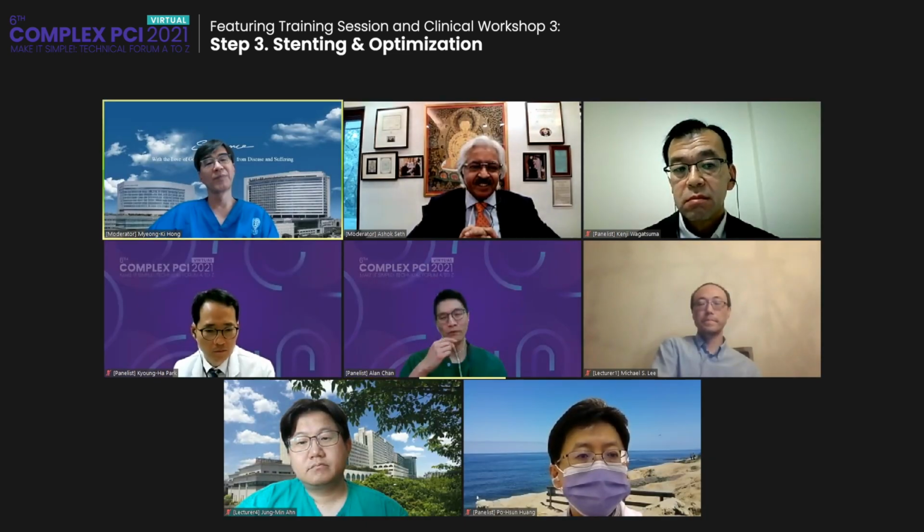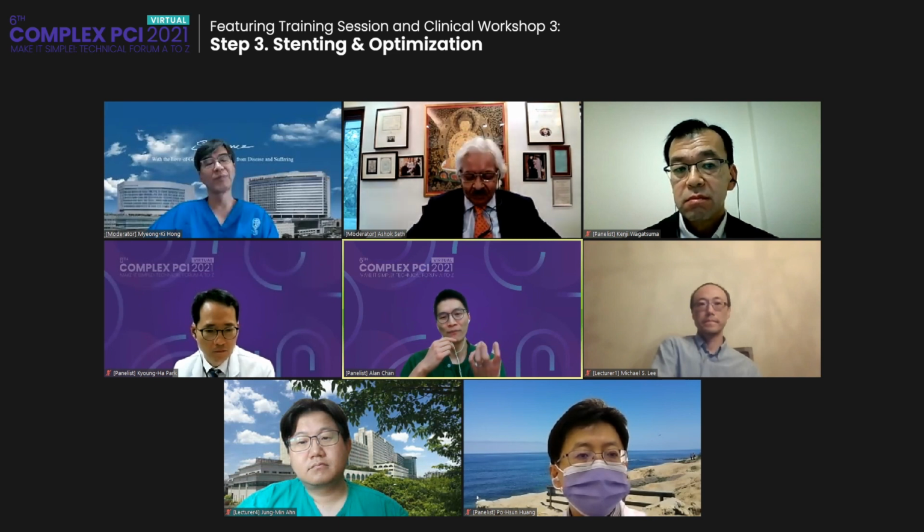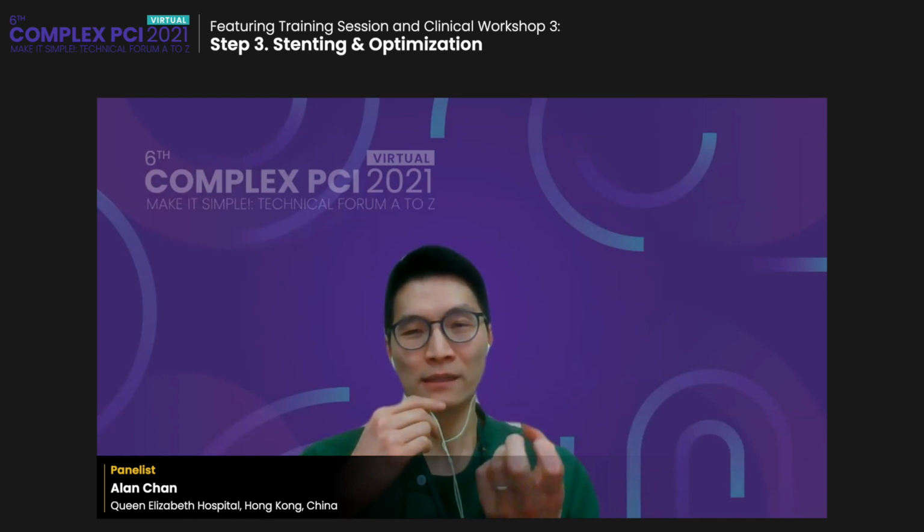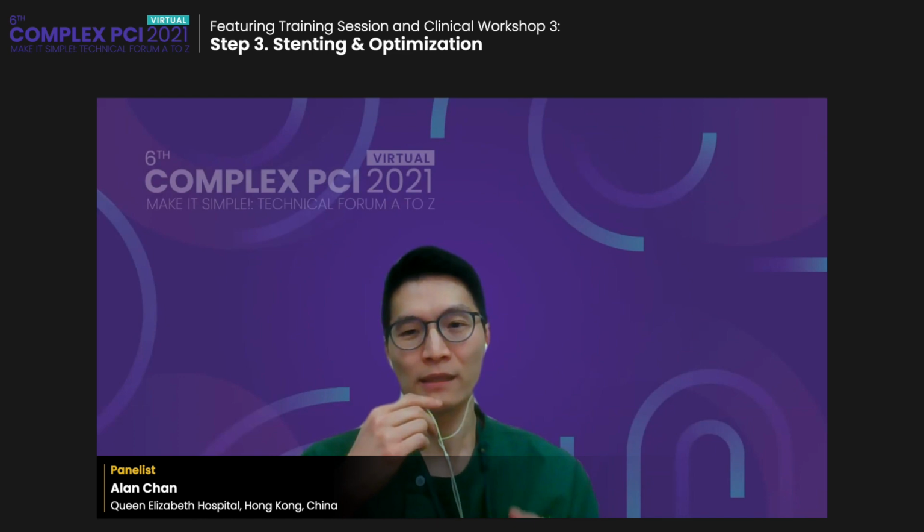Basically, if you want to incorporate everything we learned today, we had topics about two-stent, one-stent, how to optimize it, imaging guidance. In case we incorporate everything together, a decent, meticulous, IVUS imaging guided approach to any kind of bifurcation is essential.